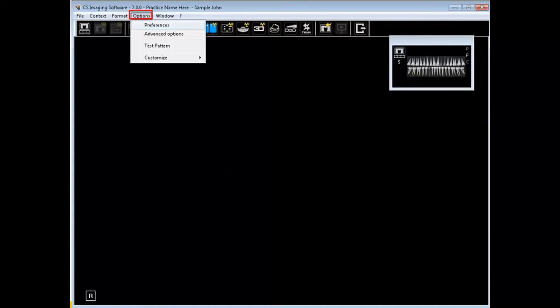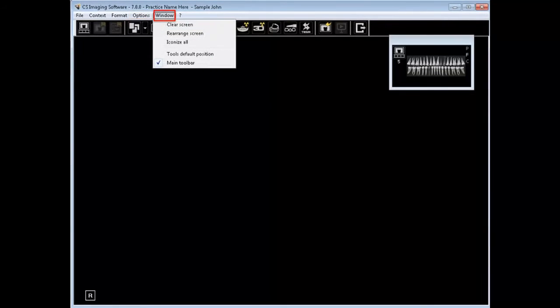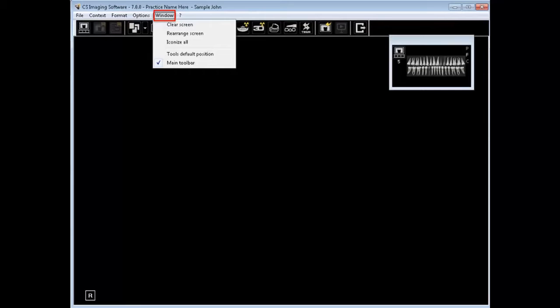Use the window menu to arrange windows in your work area. Clear screen to close all images on the screen. Rearrange screen to reposition and resize images on the screen. Iconize all will minimize all opened images. Tool's default position will place the image processing tools such as enhancement tools and control panel and the patient history window to the system-defined positions.